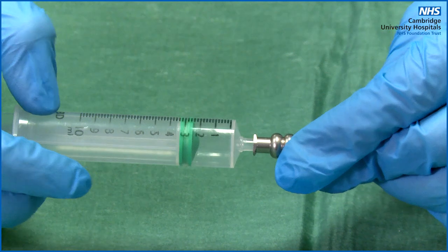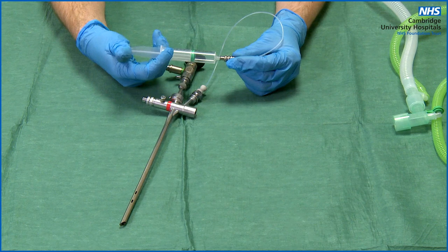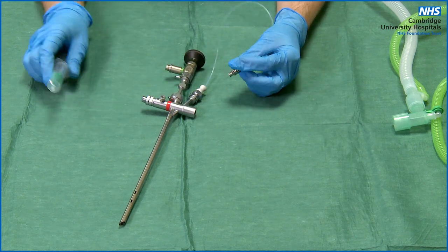One in 10,000 adrenaline is used to decongest around inflamed foreign bodies. The suction catheter is used to introduce the adrenaline down the scope.